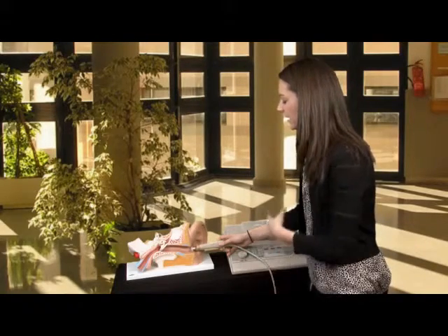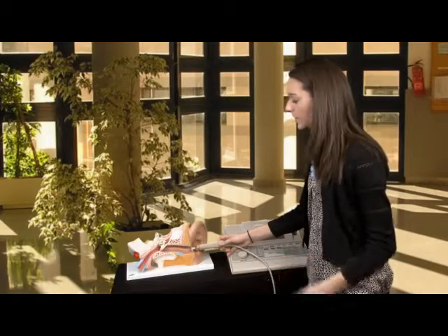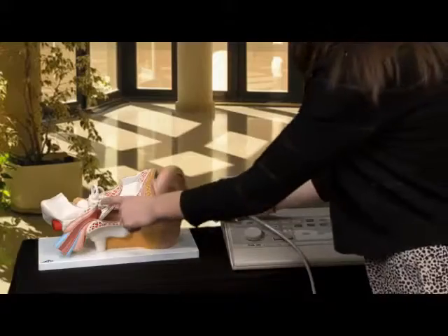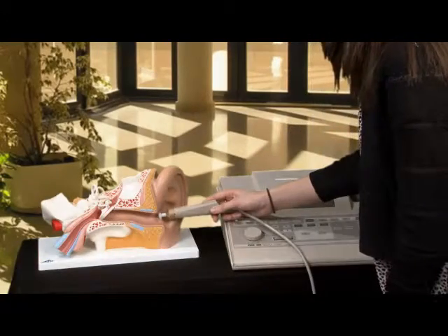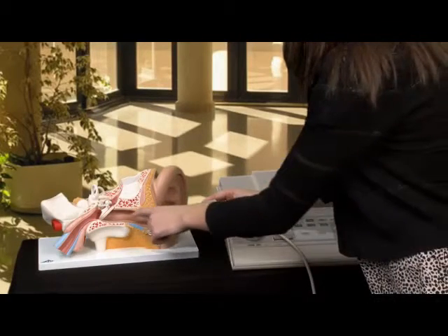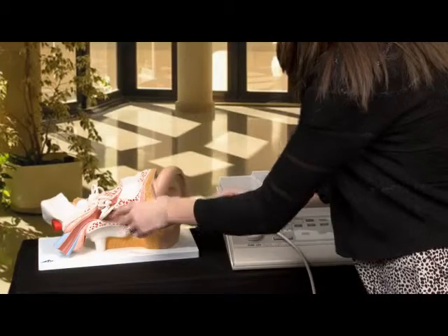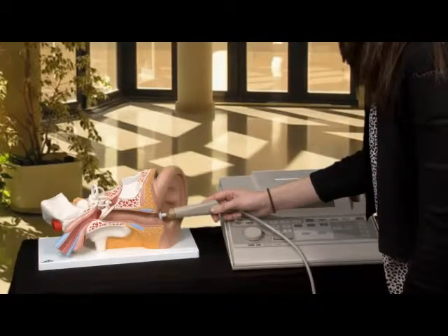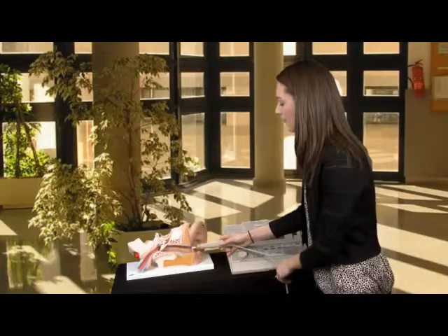If there were a middle ear pathology such as a middle ear infection where there's fluid in the middle ear space, the tympanic membrane will be stiffened. As the sound travels through the ear canal and hits the tympanic membrane, less energy will be absorbed by the middle ear, and more energy will be reflected back and picked up by the probe.